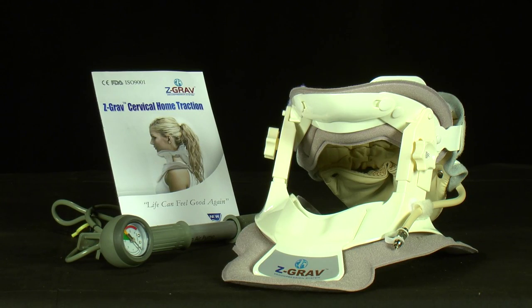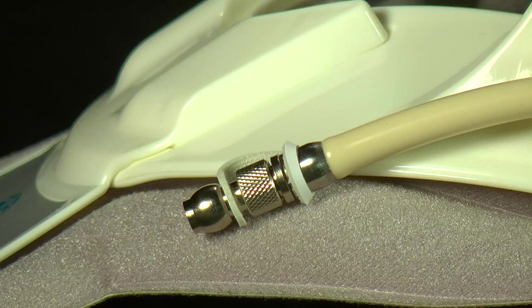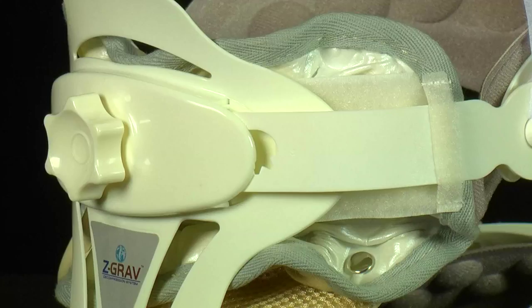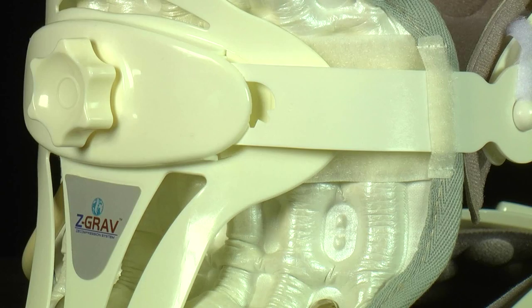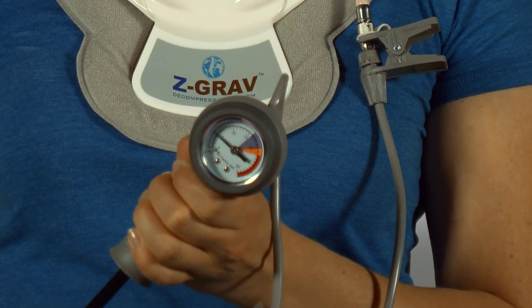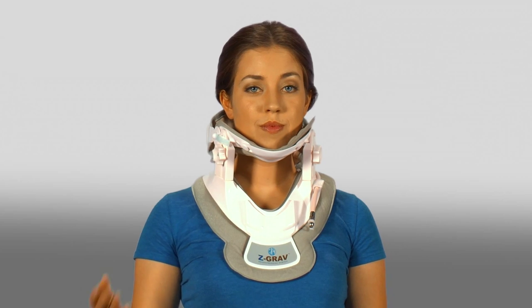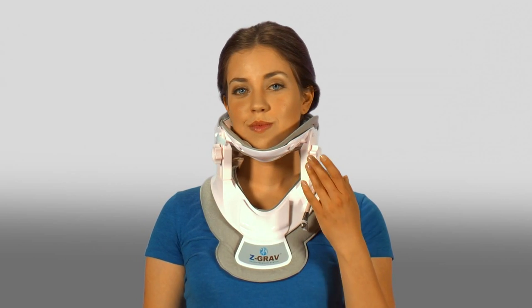Prior to using the Z-Grav collar, please familiarize yourself by reviewing the instruction manual. Be sure that both the valve stem and valve are closed by rotating to the right. If the valve or stem is loose, the air columns will not retain air. You should practice inflating and using the hand pump provided prior to applying the collar. Long hair should be affixed up and out of the way. You may prefer to lift hair over the top of the rear component. Remove earrings or other objects in or around the ears. There are three rotating knobs that can be adjusted to individual comfort.